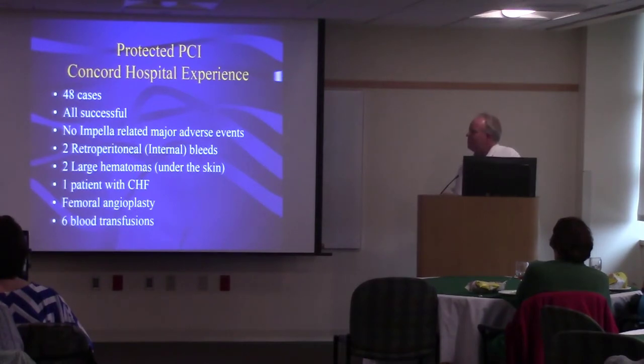It's usually self-limited. We had one patient with worsening heart failure. Again, we were able to manage that with medications, and then the femoral angioplasty I told you about. 6 patients have required blood transfusions, but for the most part, we're quite pleased that we've had some minor complications, but no major events. And again, these are patients who probably wouldn't be with us today if we didn't have this device to help us.